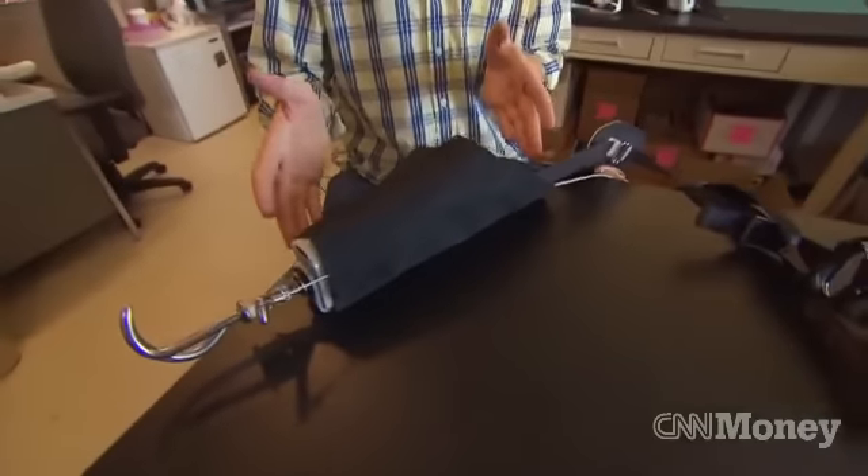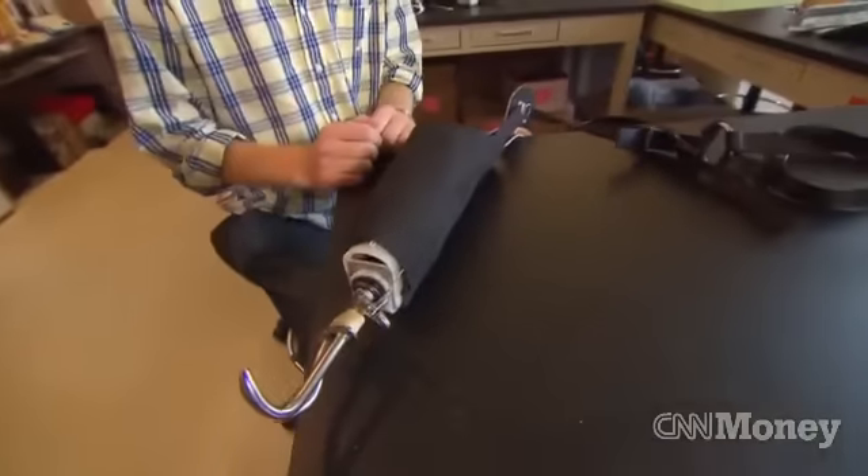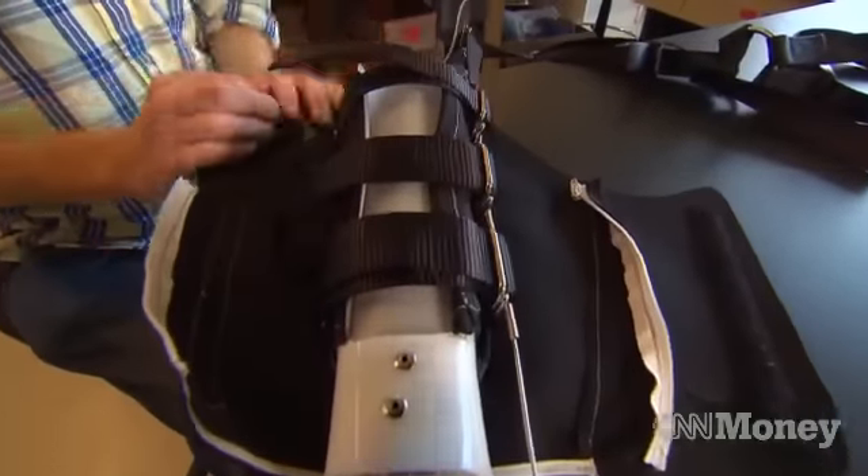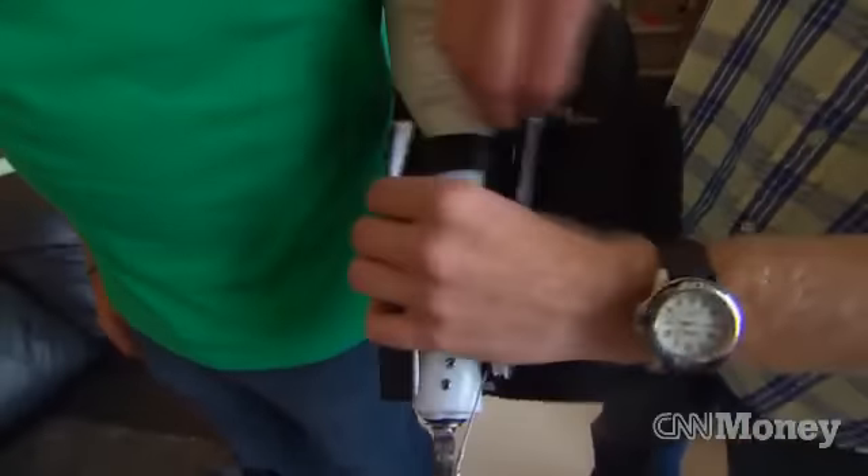The socket is really the part where we've done our innovation. It uses both rigid plastic pieces and flexible cloth pieces to enable it to be very easily adjustable.